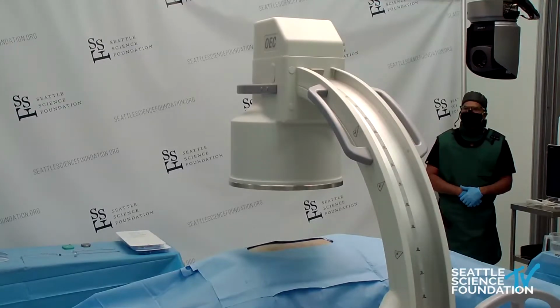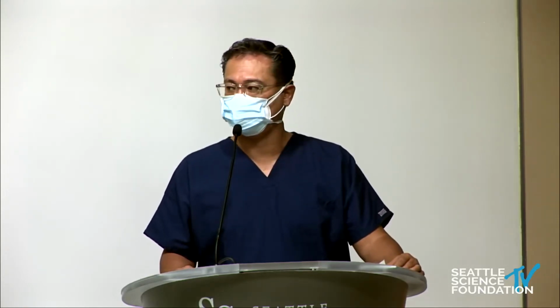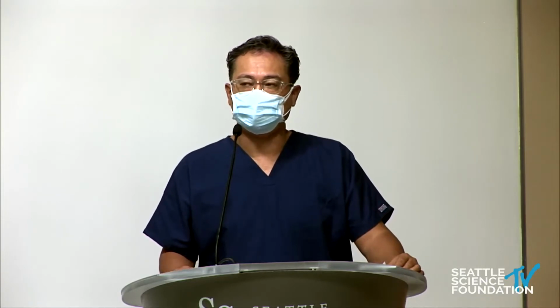Right away for me, it's making sure you have the right patient, and that you can do it in a safe manner, keeping the patient safe and doing it efficiently without causing any harm. Once that is done, it's looking at the hardware, any spinal stenosis or any hardware in the region, and targeting which area of the spine you want to cover, whether it be the low back or lower extremities. Ahead of time with the technologist, you make sure you're getting to and covering that area while the patient is in the procedure room.